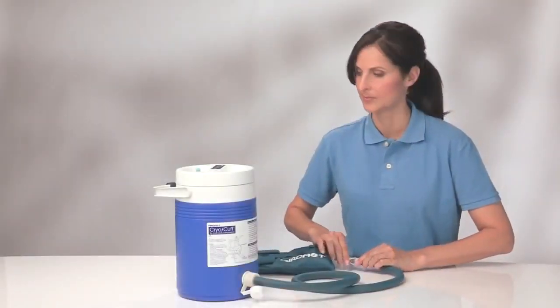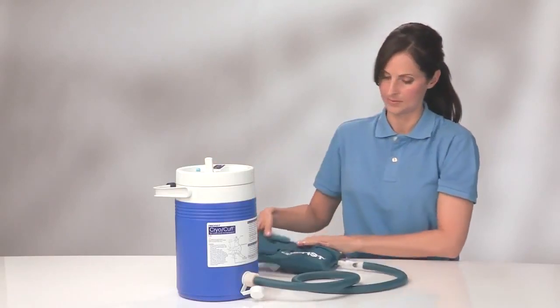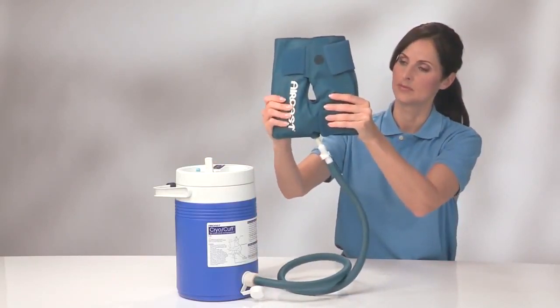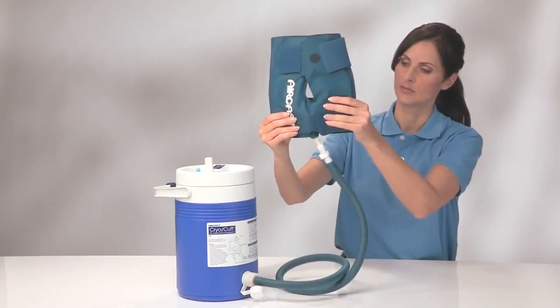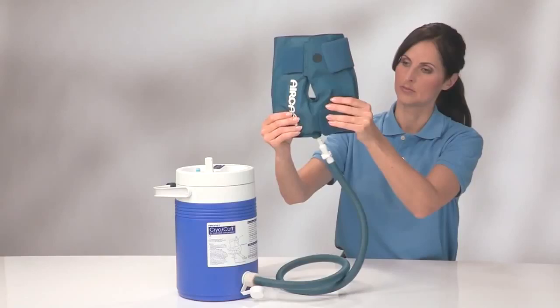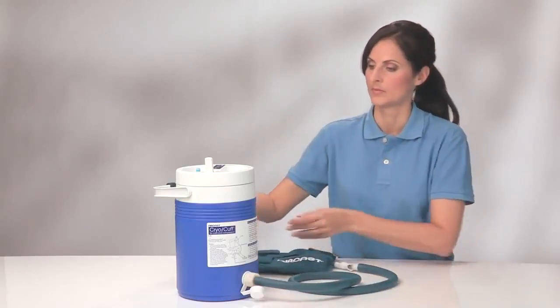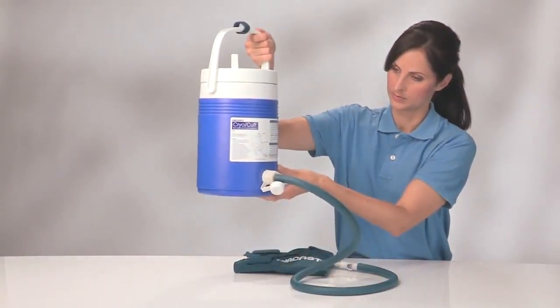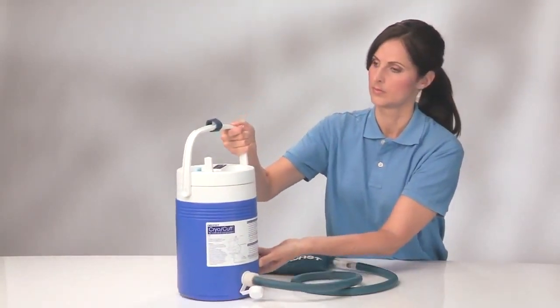Start by reconnecting the blue tube to the cuff. Open the vent and then lower the cooler below the cuff. Let the warmed water drain into the cooler and allow a minute or two for the water to mix with the ice and re-chill. Then raise the cooler above the cuff and repeat the filling process. Prior to re-filling and after each use, empty the cryo-cuff.